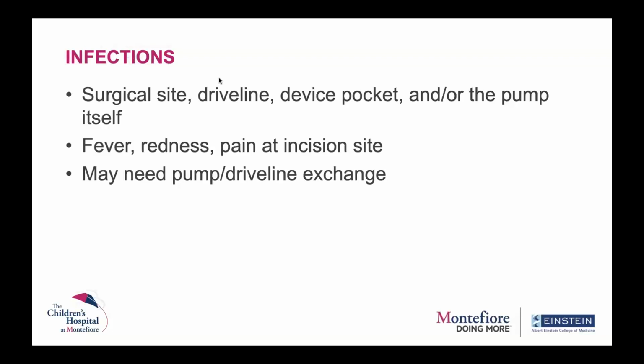And infection is one of the major problems as well, because now you have a surgical site where you've implanted this device. In a lot of these devices, you have this driveline that comes out and connects to either the power outlet or the batteries. You have the device that is sitting inside the heart, most of the time, and the pump itself, which is a foreign body sitting inside the human body. So those are all risks for infection. You can have fever, redness, pain at the site, and sometimes you may need to exchange the pump or the driveline.